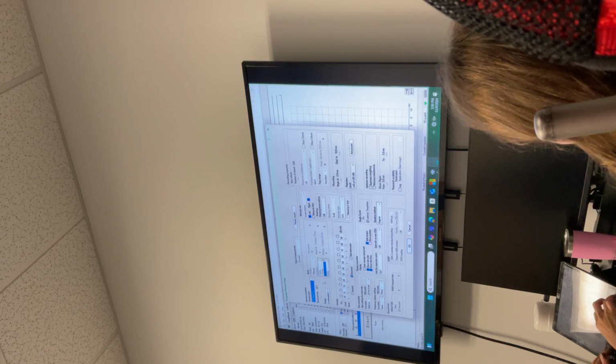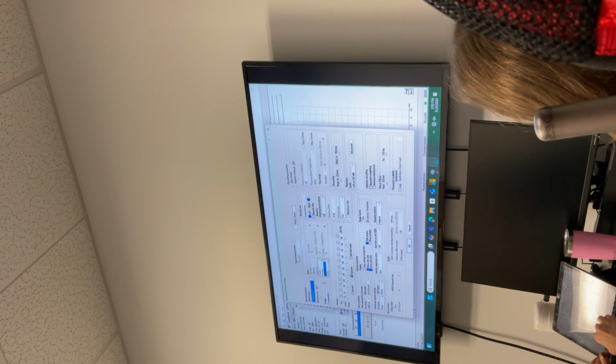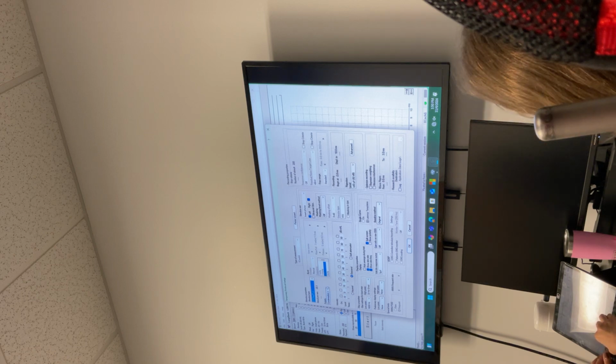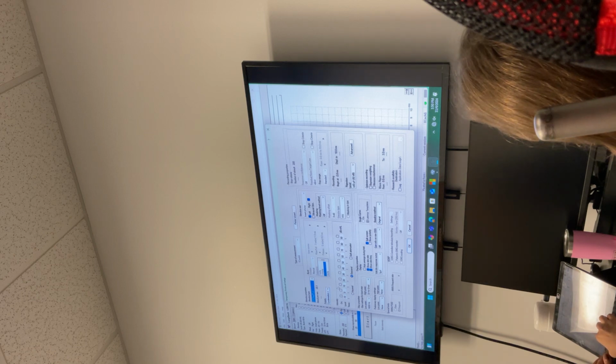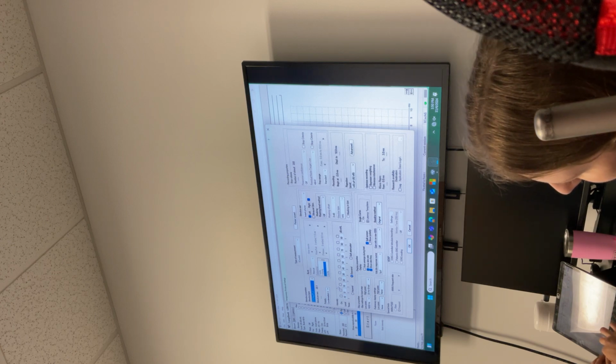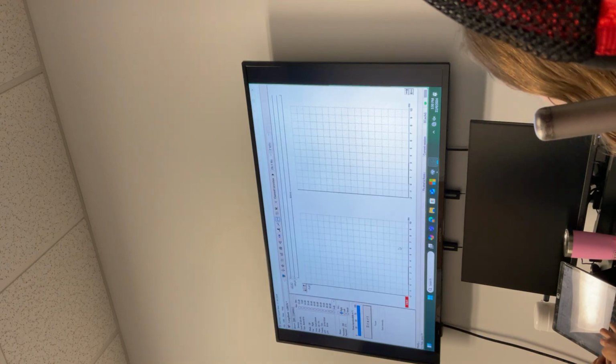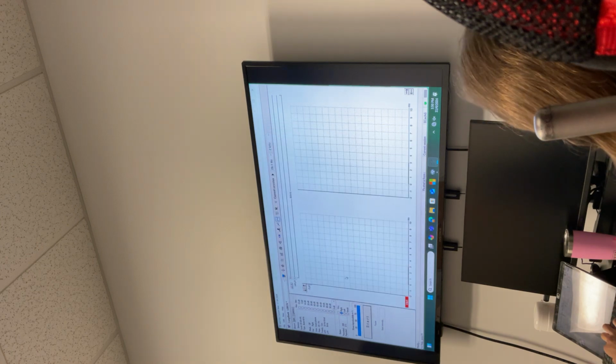What's the polarity we're doing here? We're going to do alternating for the labs. For now, the problem with visualizing alternating is that it will all get cancelled out. You have to select only one polarity for the loop back. But during our labs we'll select alternating.